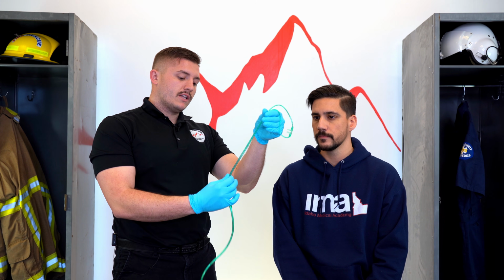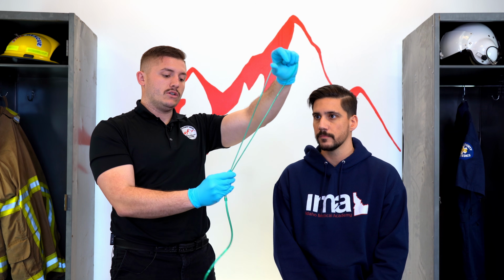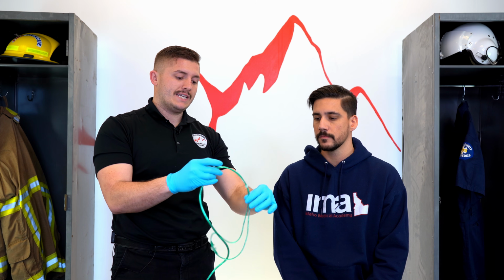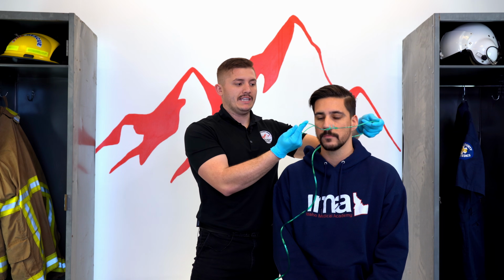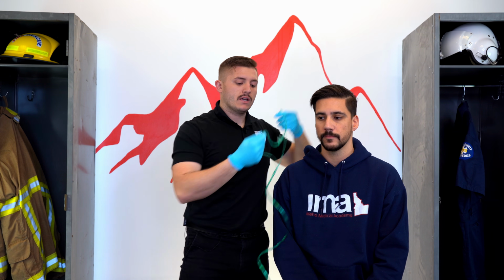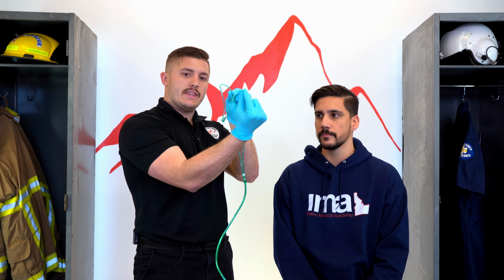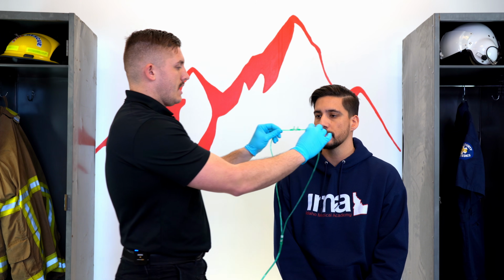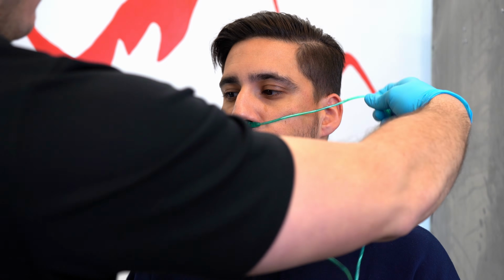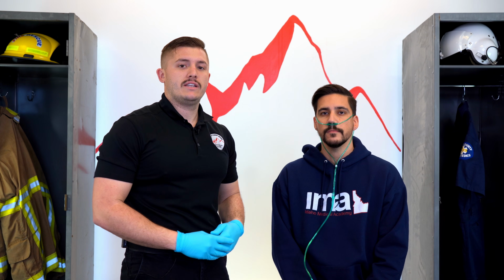So one thing we see in the field a lot with somebody who's doing this for the first time, they look at this. This is going to actually loosen this little tab here and tighten. But one thing we see a lot of is they try to go around the patient's head like this. This is actually incorrect. So what we want to do is we want this to sit around the patient's ears and that be in their nose, this part be in their nose. So one thing I do first is I take it, place it in my patient's nose, and then I come around the ears like so. And now I can actually tighten it. And now my nasal cannula is placed.